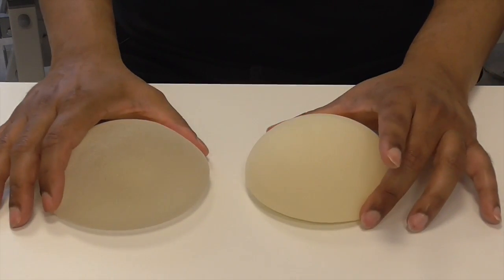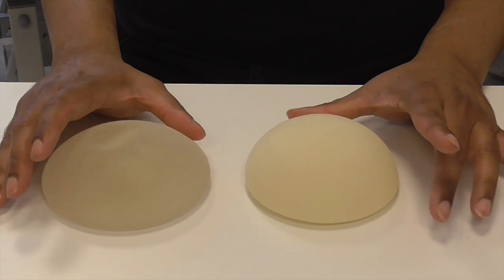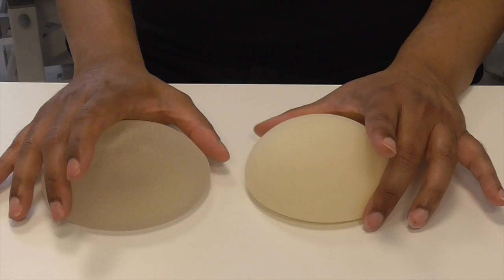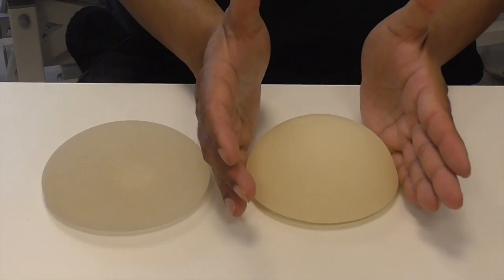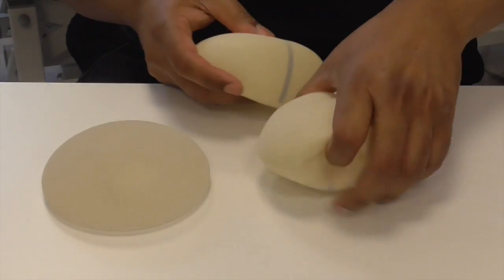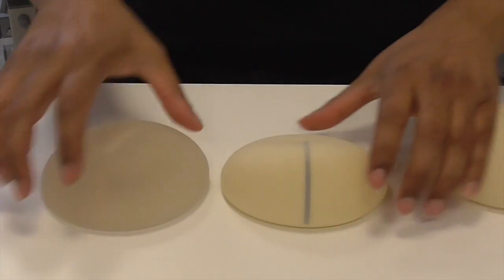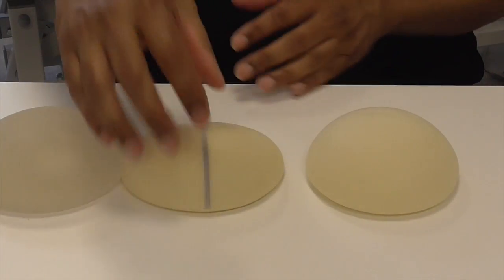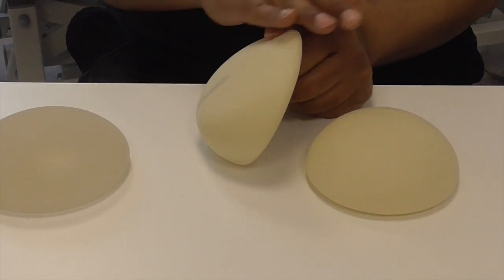Now these two implants we have are what are called round implants, meaning that they're hemispherical, and many people use these if it's suitable for the patient. But other surgeons like to use what is known as an anatomical implant.